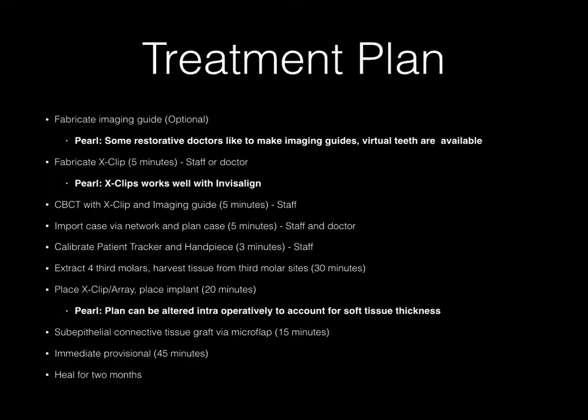We're going to import the case via the network in the office and plan the case — this takes less than five minutes. We're going to calibrate the patient tracker and the handpiece; the staff does this and it takes less than three minutes. In this case I'm going to extract four third molars and harvest soft tissue from the maxillary posterior region number 16 for a sub-epithelial connective tissue graft, which will be done concomitantly with the implant placement. The implant will be put into position in less than 20 minutes.